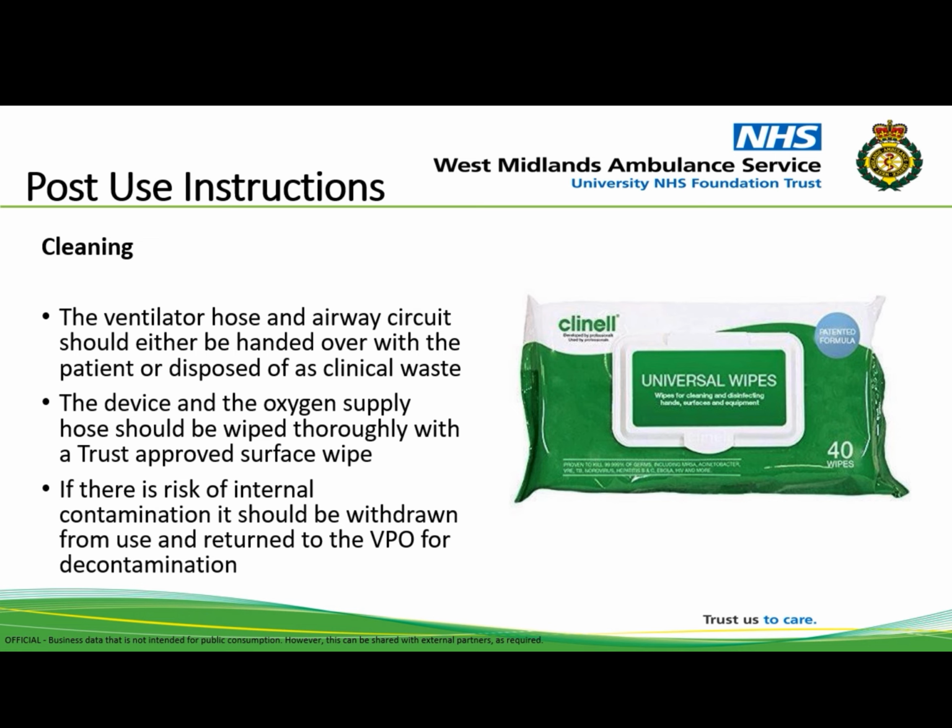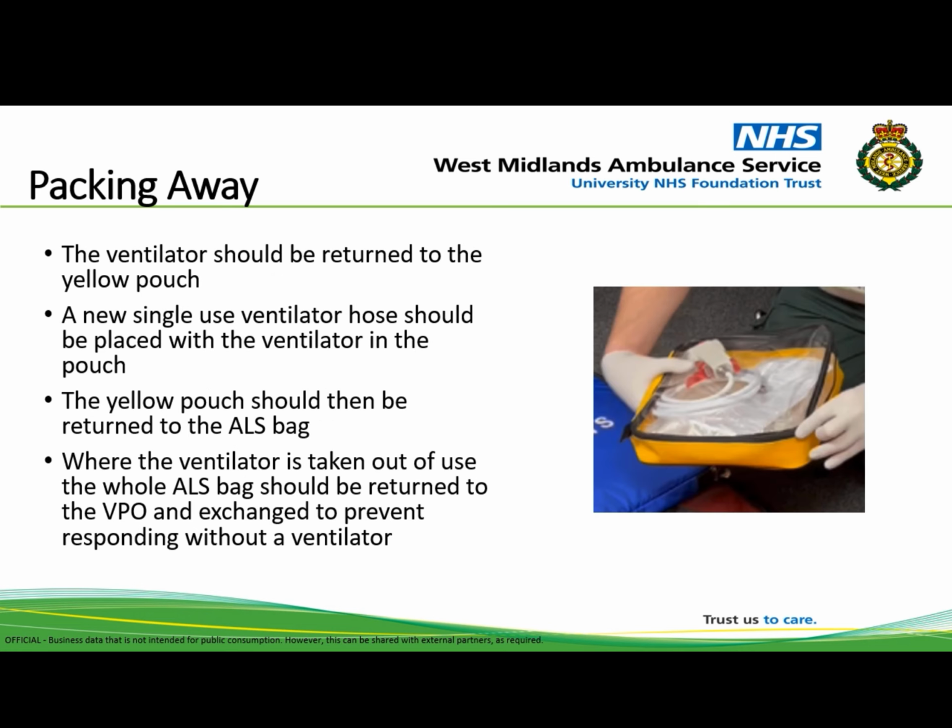When the ventilator's been cleaned, return the ventilator to the yellow pouch along with a single-use ventilator hose. This should be then returned to the ALS pouch. Where the ventilator is taken out of use, the whole ALS bag, including the ventilator, should be returned to the VPO and exchanged to prevent responding without a ventilator.